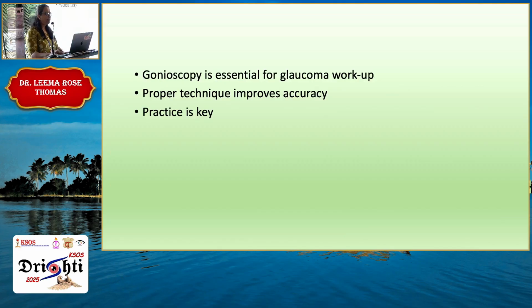So gonioscopy is essential for glaucoma workup and maybe many other pathologies in the eye. Proper technique improves the accuracy.